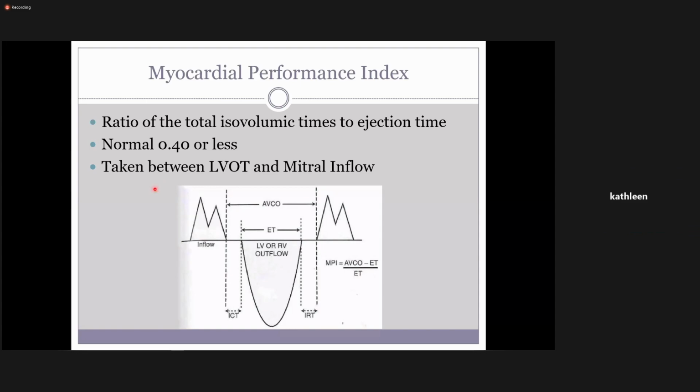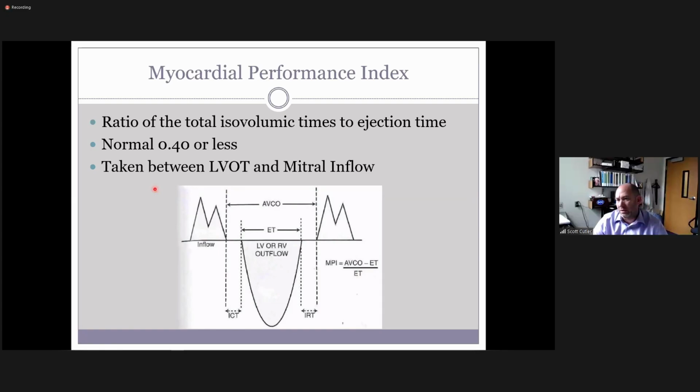Scott, I have a question. Yeah, go ahead. How much of all of these values do you remember? And how long did it take you to get to a point when you were scanning that you remembered all these normal values? Honestly, unless you do it all the time, your lab is going to have 2 or 3 main things that you look at. Anything else is going to be a table in a book that you look up, or it might be a table on the wall in your lab. Typically your lab is going to narrow it down to the most common measurements that you're going to take, just as a quick down and dirty.